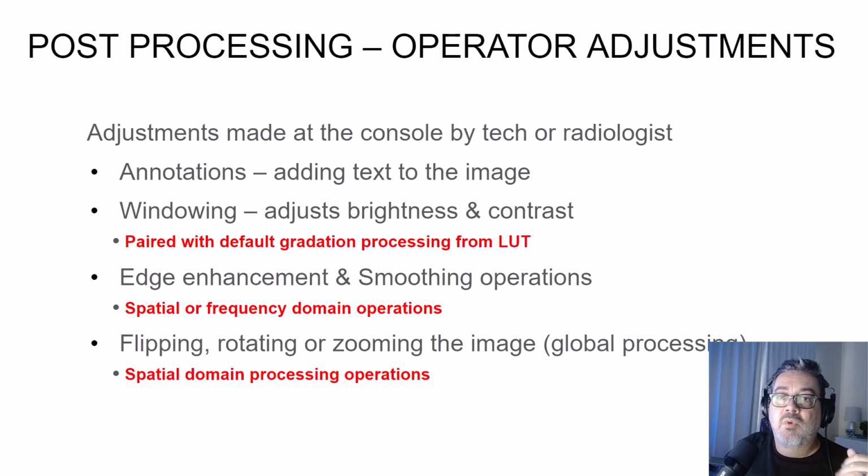Windowing, meaning window level adjusting the brightness and window width adjusting the contrast. This gets paired with the default gradation processing from the lookup table that you selected. And that's done when you identified the part or projection prior to image acquisition.